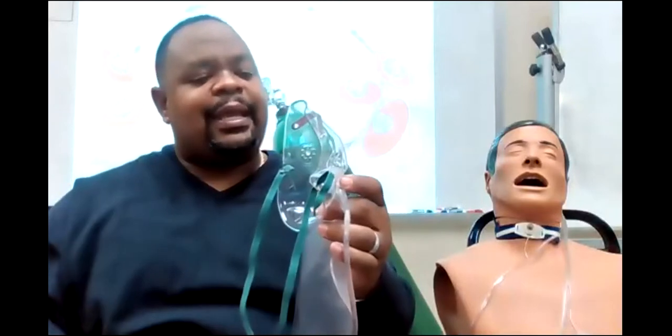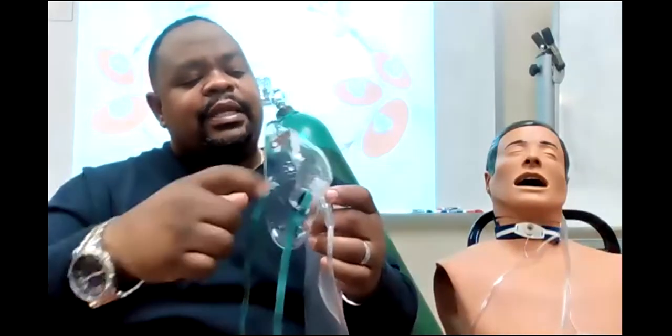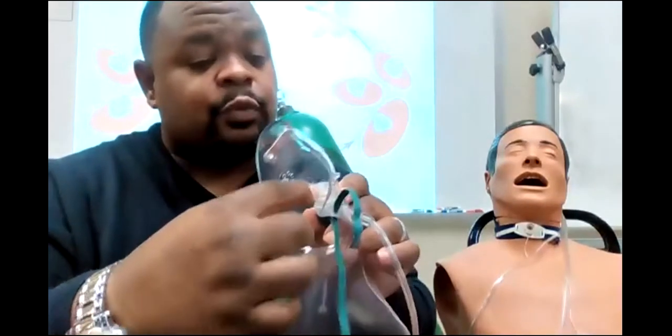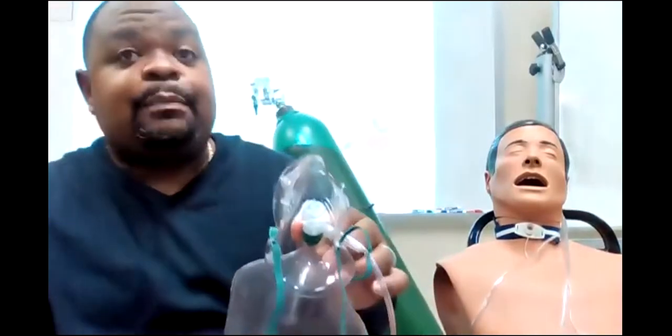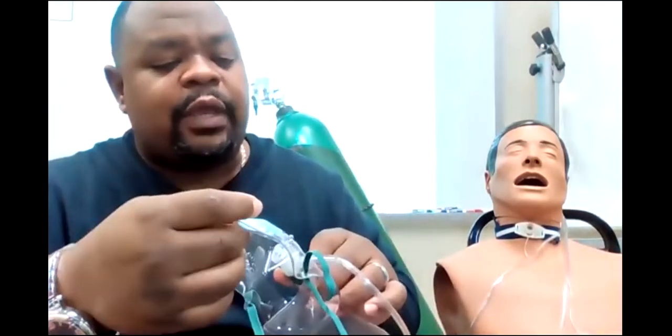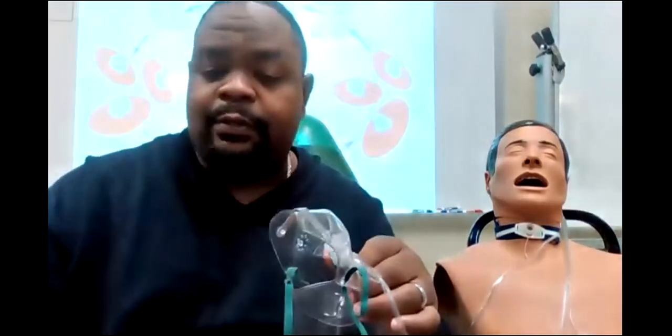Partial rebreather, the first one-third of my breath goes into the bag, and it does not have a valve between the mask and the bag. That is the key point of the partial rebreather mask, okay? It can give you FiO2s up to about what?